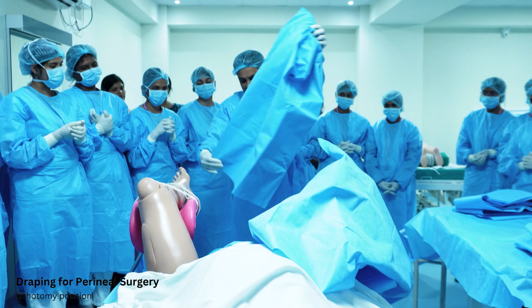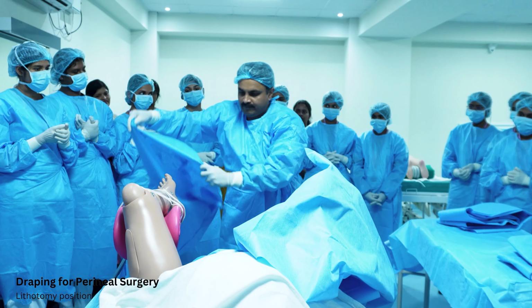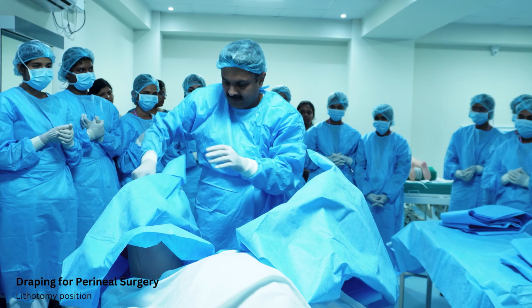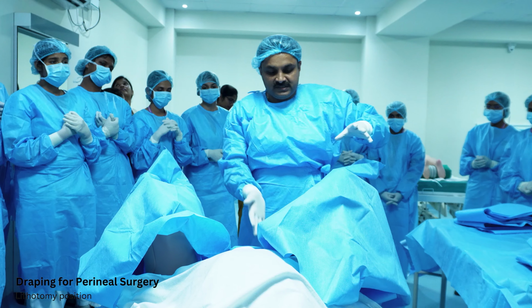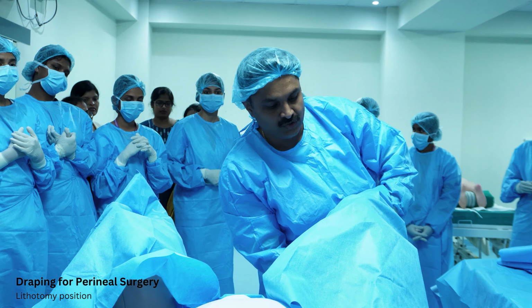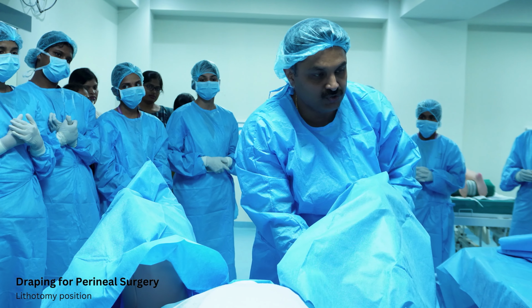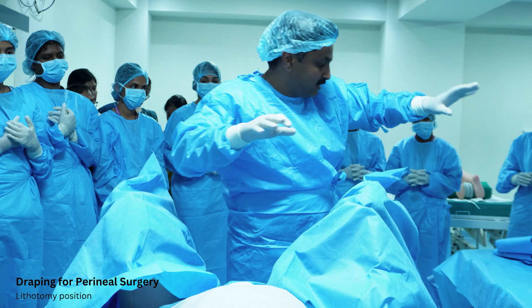Okay, I'm just looking for the slit. Okay, this part. So now it is safe. And the good thing is, even if you want to adjust the leg towards one side, you can easily adjust it according to your convenience, and you can tighten it, because I have draped it. It is completely straight.